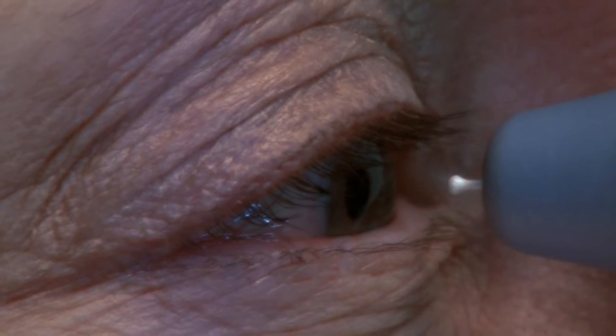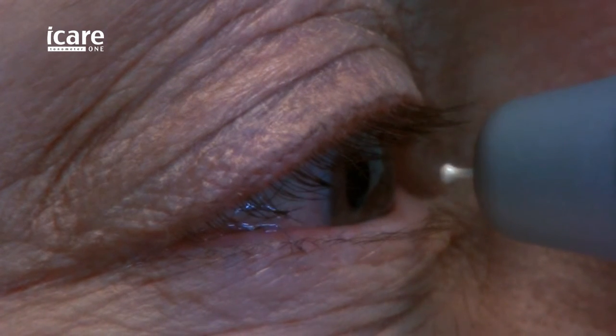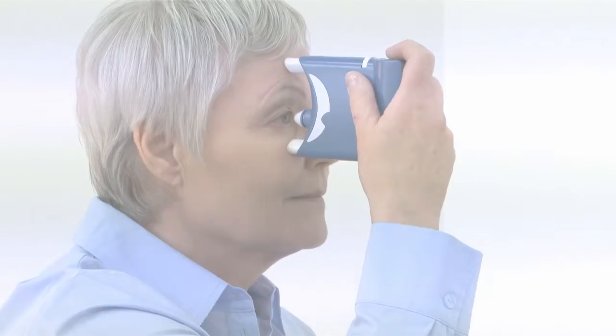A measurement sequence is a set of six measurements. Six measurements are necessary to obtain the most accurate reading. The patient should relax and look straight ahead at a specific point while keeping the eye wide open and steady.